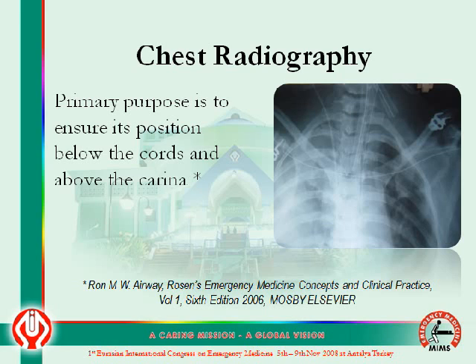This will never confirm a tracheal intubation or rule out an esophageal intubation. If you want to do that, you should also go for a lateral film along with the AP film.